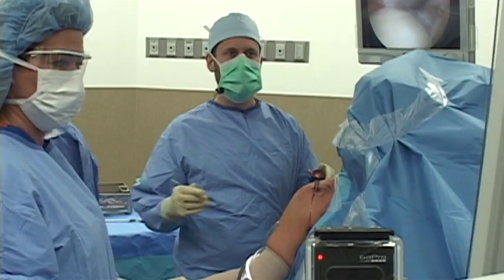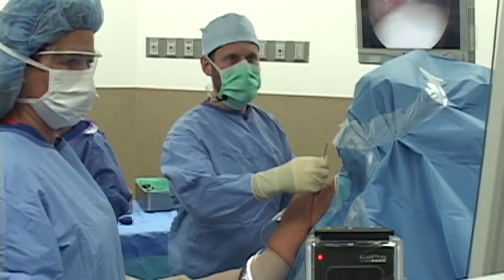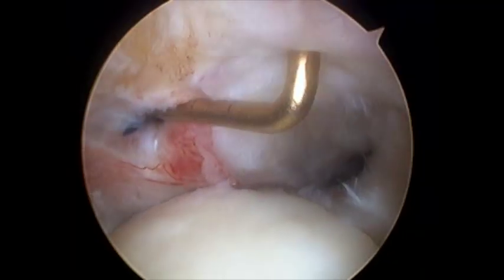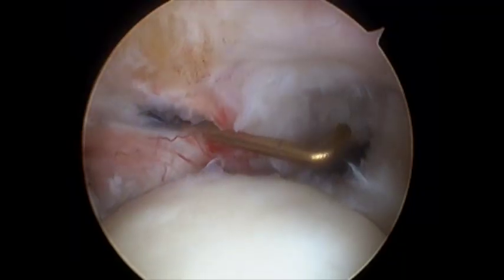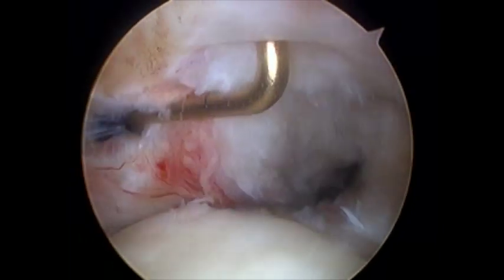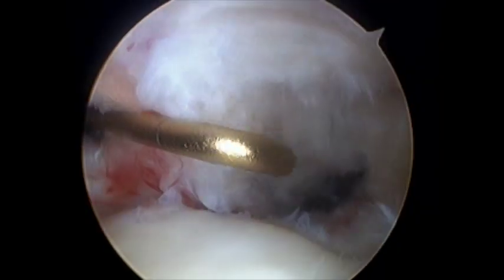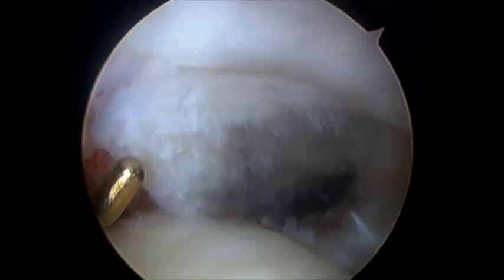Just to demonstrate what the tear is: if I put a probe here and push it in, this is normal tendon tissue — this white structure here. Now there's a defect or a hole. This tissue belongs stuck down here. Tendon, bone — that tendon belongs stuck to that bone. And the way that we're going to attach it is with an anchor.